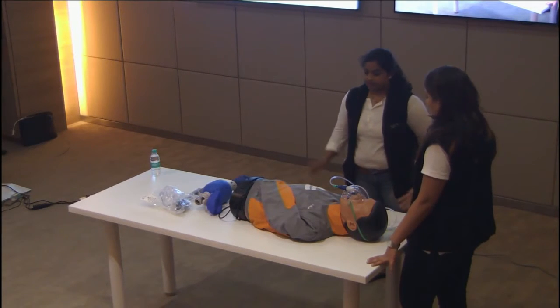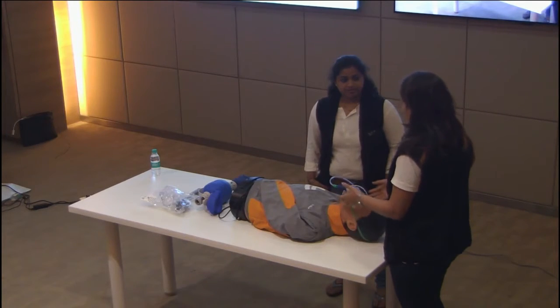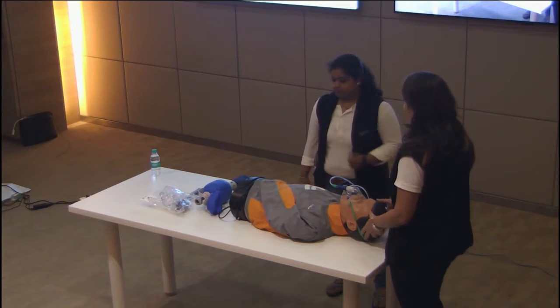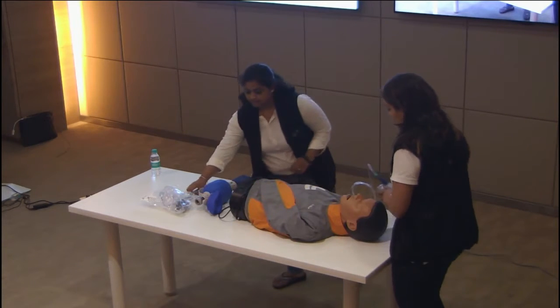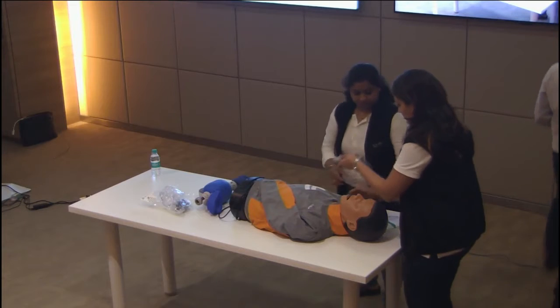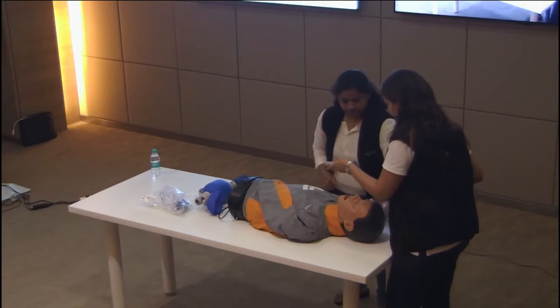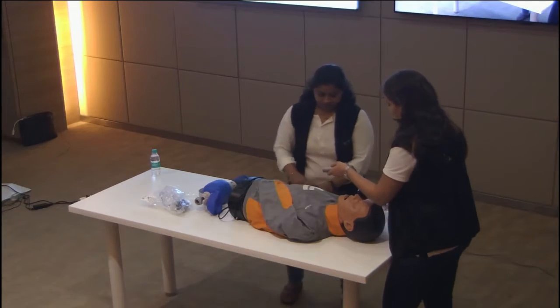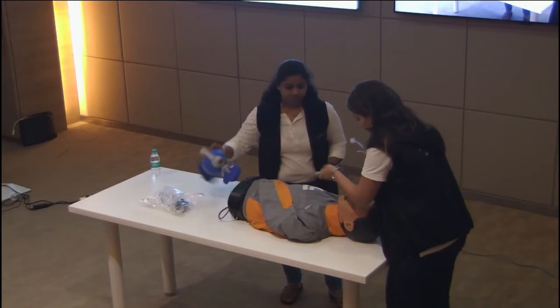I think we should help him with an NIV. We should give it a trial of NIV. What do you think? We'll intubate this patient because I don't think we have time. We are losing almost 6 minutes out here. Okay, so I think we just get our trolley and we start with the intubation for this patient. We can't afford to lose him. We need to give him medications first. Yeah, please give him the medication. Give him propofol and succinylcholine. Give it. We can't waste time. We have to intubate this patient.